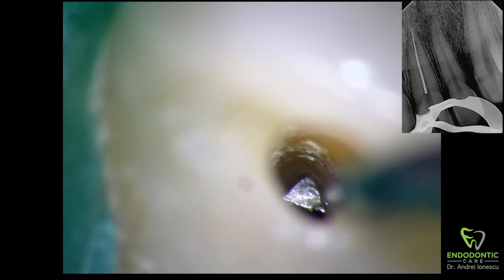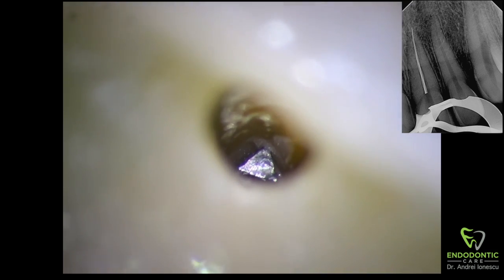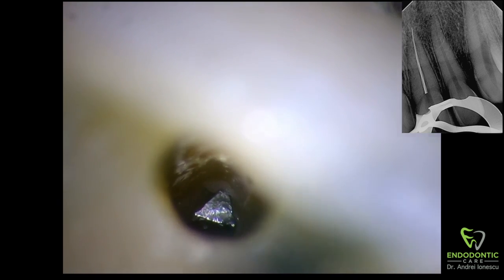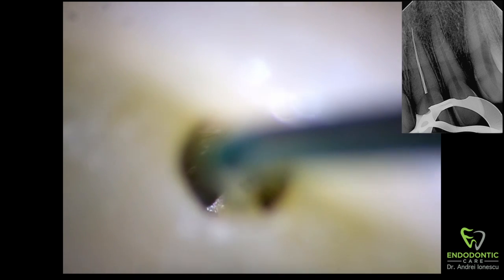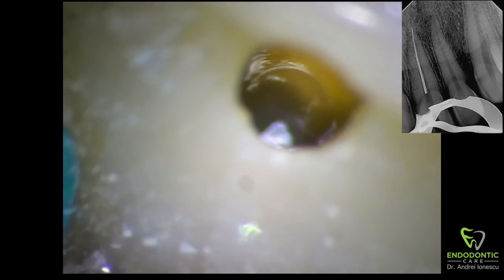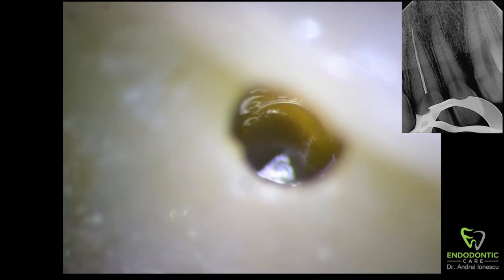Here I'm trying to see how loose it is. You can move it — it is loose coronally, though it may be bound further down. At the top you can move it around a little bit, but because the canal has a curvature towards the palate, the file tip tends to straighten out, so it's resting against the buccal wall. My concern was how am I going to get the lasso wire around the file buccally so that I can grab on to it with enough grip to pull it out.